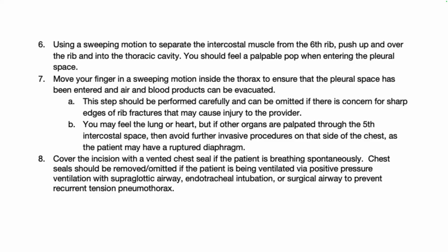After the procedure's done, we're going to only cover that incision with a vented chest seal if the patient's breathing spontaneously. If the patient's being ventilated by positive pressure ventilation with a supraglottic airway, endotracheal intubation, or surgical airway, we're going to leave that wound open because we want that air to be able to escape so they don't develop a recurrent tension pneumothorax. So it depends what the patient's doing.